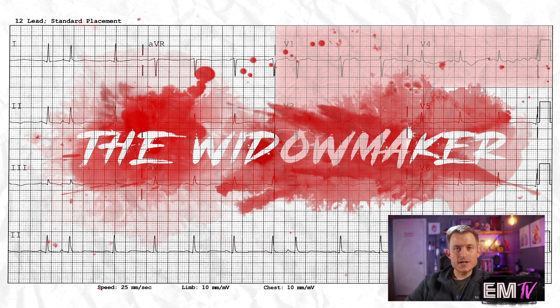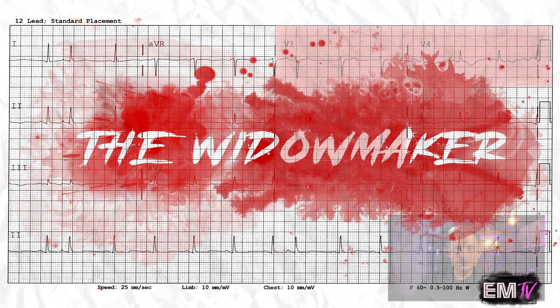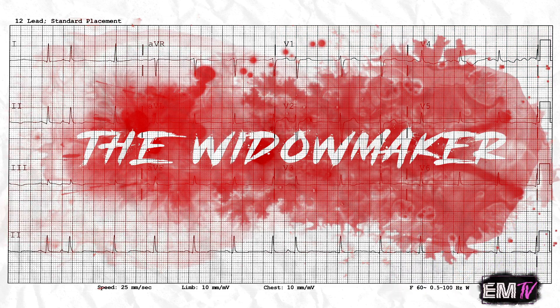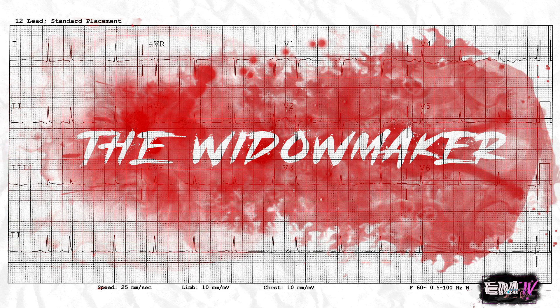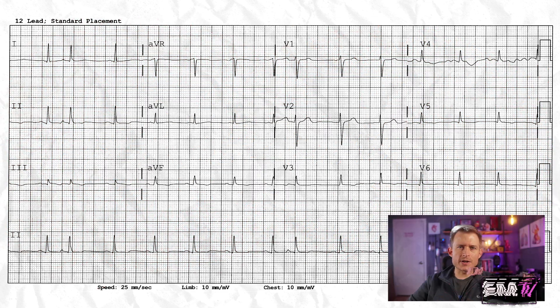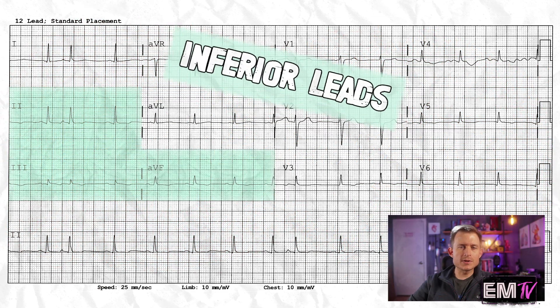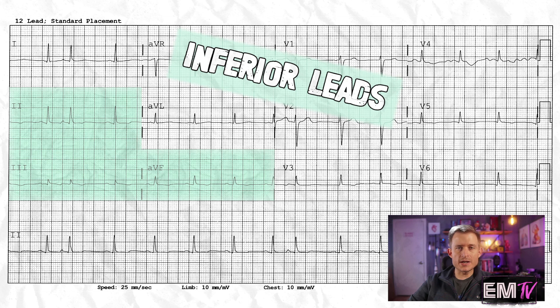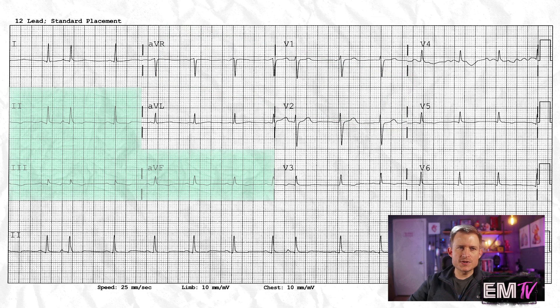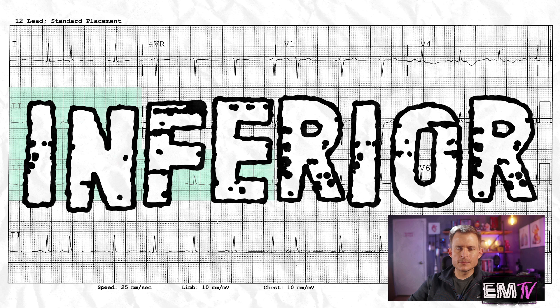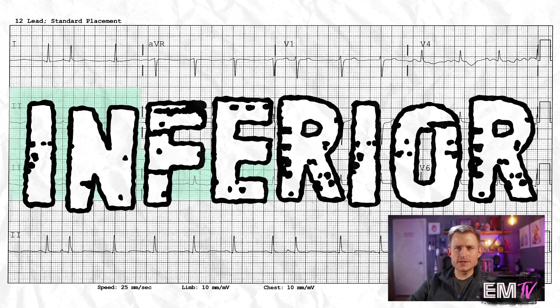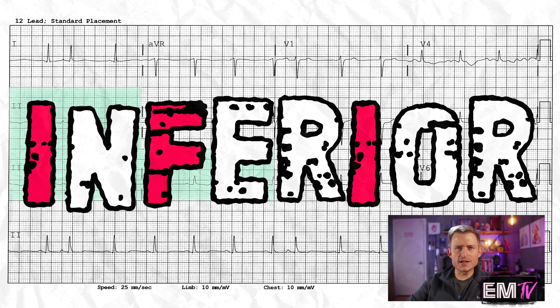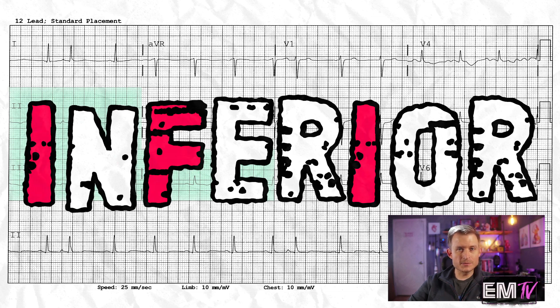Lay people sometimes refer to this as the Widowmaker. The next leads I look at are the inferior leads — leads 2, 3, and AVF. These clump nicely together on the bottom left of the EKG. A way I tell my students to remember this lead grouping is to look at the word 'inferior' — it contains multiple I's and an F, not a single I, but multiples.